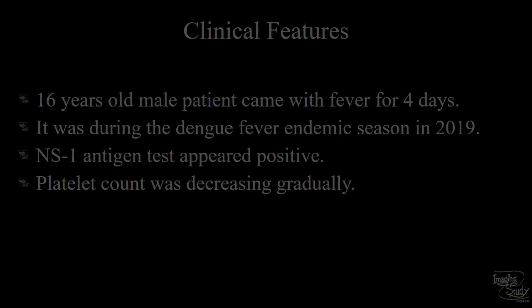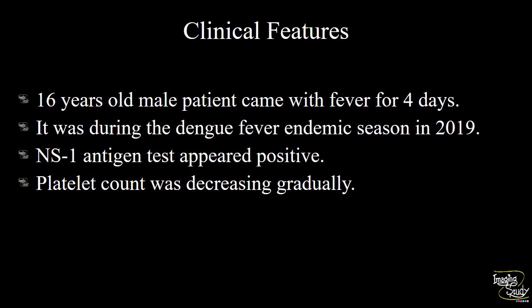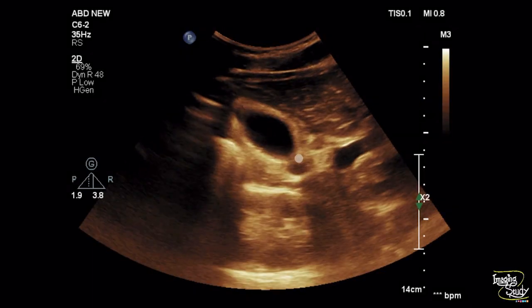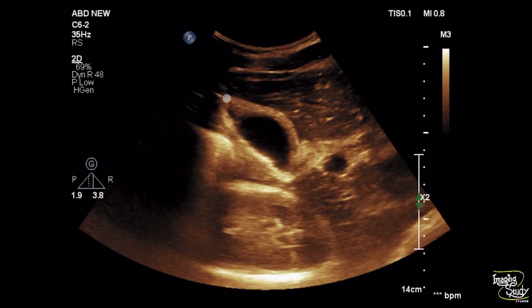Let's start with the first case. A 16-year-old male patient came with fever for four days. It was during the dengue fever endemic season in Dhaka in 2019. The patient had the NS1 antigen test positive and platelet count was decreasing gradually. Here you can see the gallbladder wall is thickened and edematous.